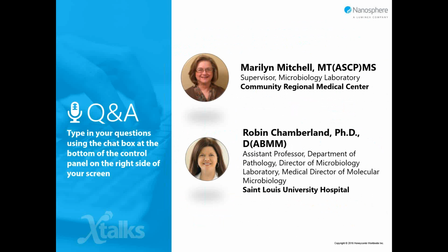We don't offer this as a stat per se. Like I said, from our ED, we don't offer it unless that patient's being admitted. But it takes just a little over 2 hours to run the test, and the setup time is just a couple of minutes. So for our bone marrow transplant patients, for example, they can get this back while they're still in the clinic being seen. So while we don't offer it as stat, we run them as soon as they come into the lab during times that we have microbiology staff here. So our turnaround is around 2.5 hours.